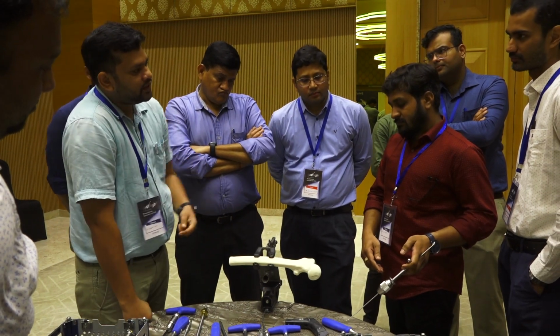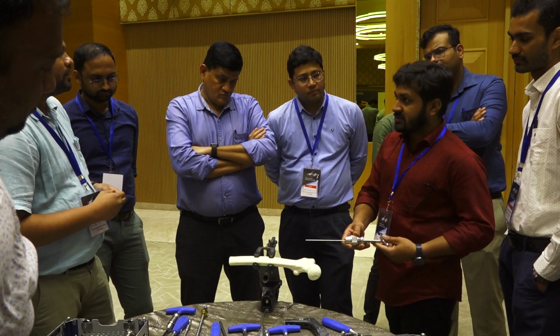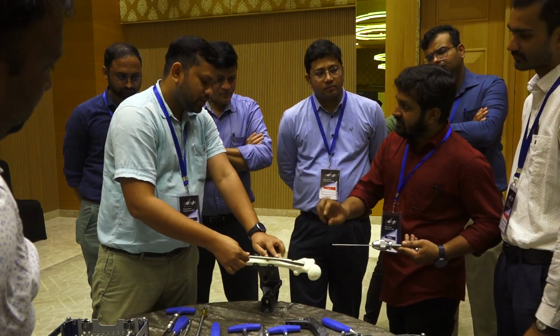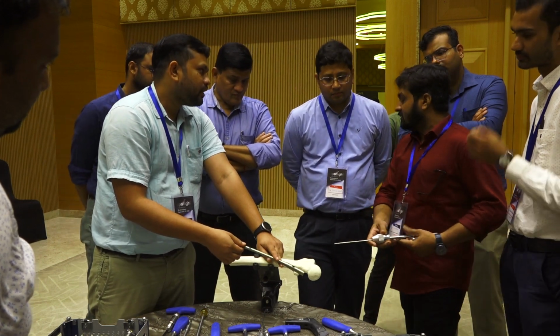How will you reduce them that? No, here I am just lifting. There is no point of a rotation. By lifting, the tip of the nail is narrow, and the proximal entry point is wider. You have some amount of play at the entry point.